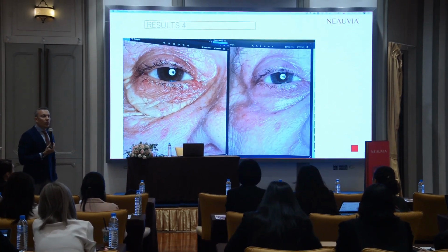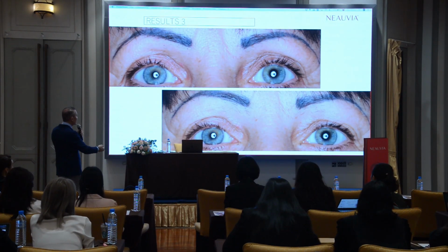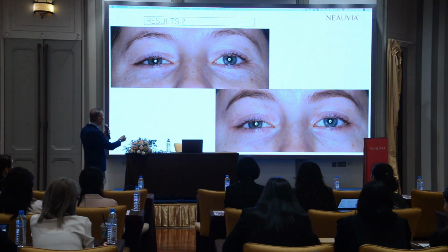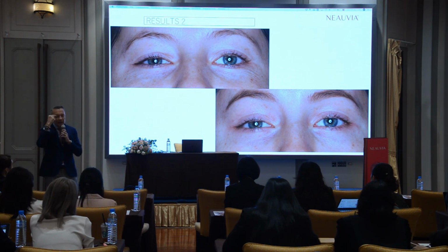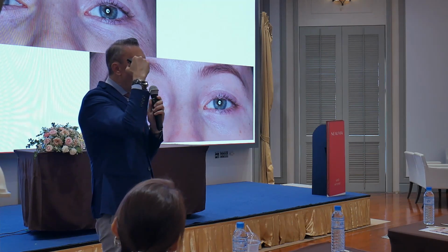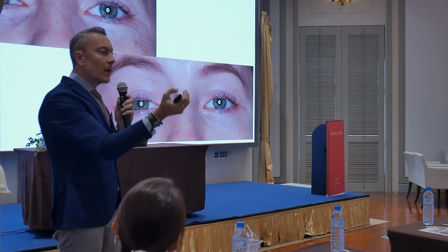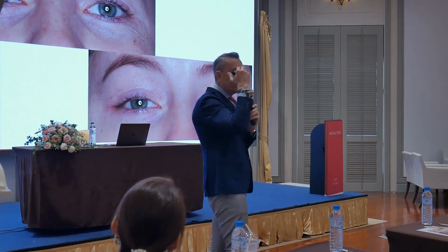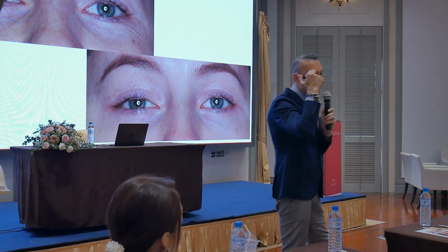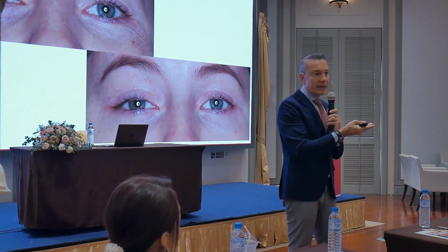Which are the treatments that we can do with plasma? Normally we do blepharoplasma, which means that we are treating the upper eyelid, and we are causing the contraction of the skin. This is good for patients with a moderate skin laxity, excess skin. When it's too much, they have to go for the blepharoplasty.